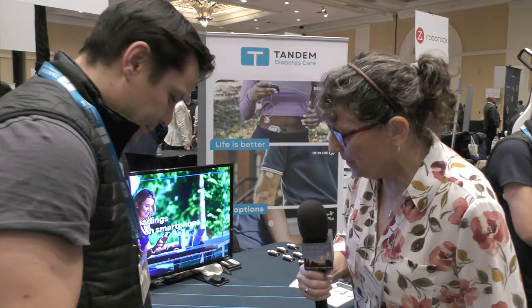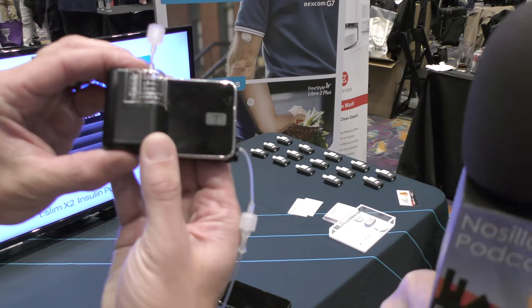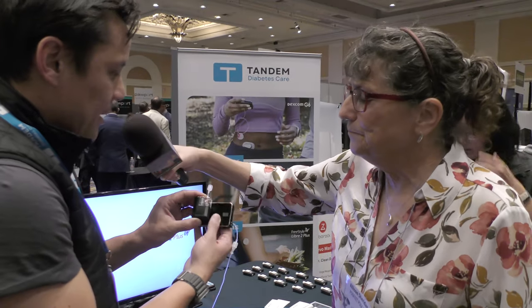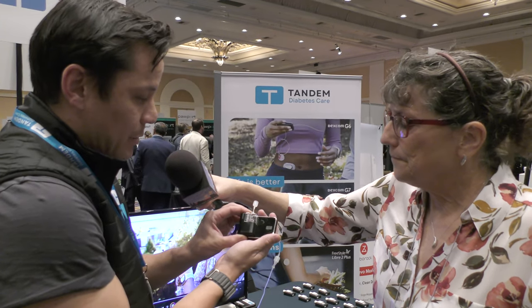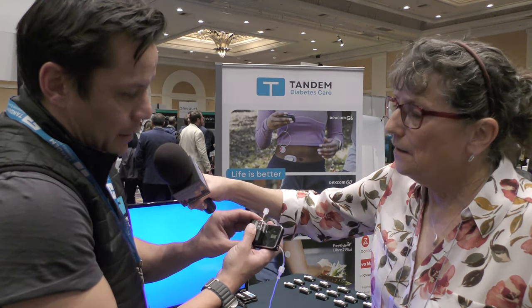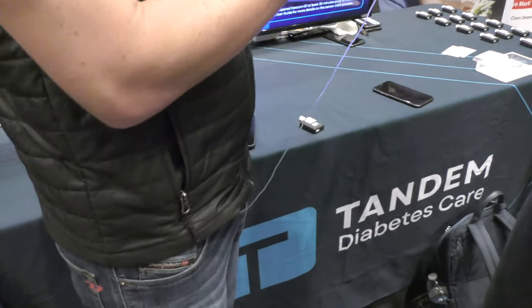The product in hand is the T-slim X2 insulin pump. There's also a smaller device — smaller than a cigarette lighter — with an interesting-looking little plastic probe sticking out of the top. That's actually the cartridge, part of the Tandem Moby insulin pump that's just in the process of being released. The cartridge holds the insulin and connects to an infusion set, which connects to your body and delivers insulin.